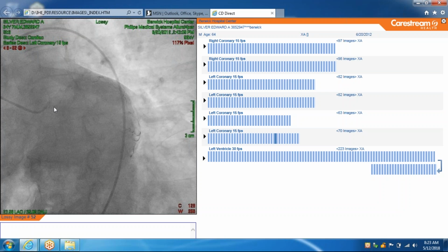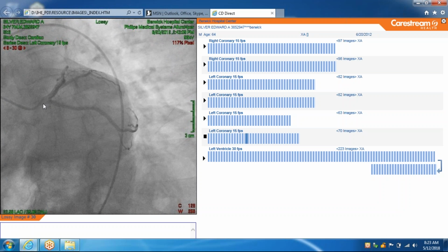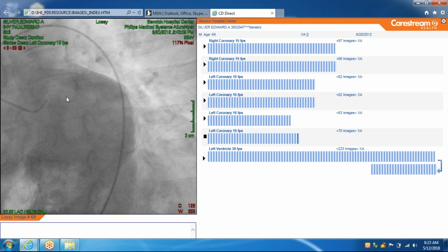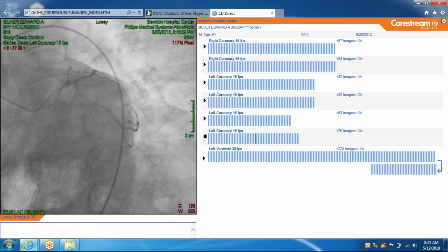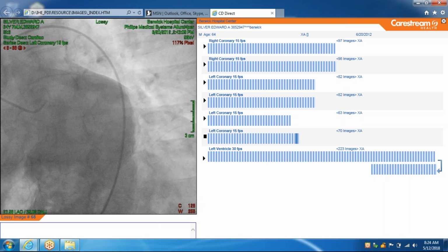So this is your left main, and it splits. This is the left main coronary artery, circumflex, LAD. All right. So you need to know what the normal blood vessel looks like, because if you have occlusion, you need to know what the occlusions look like. All right, so those are the vessels.